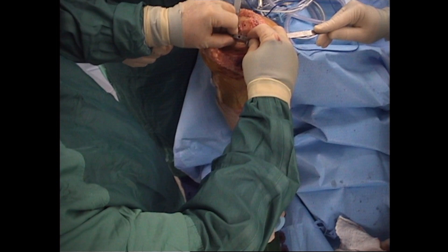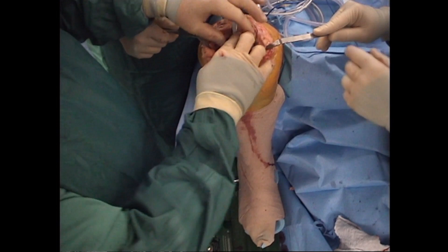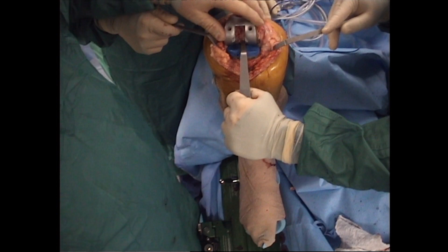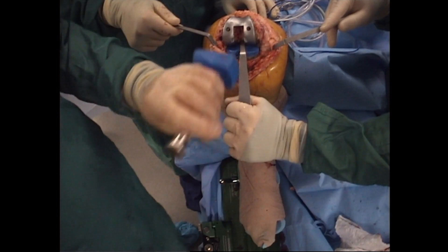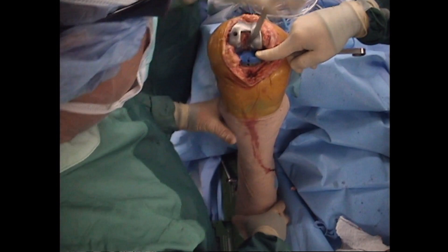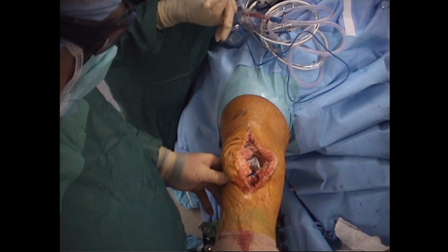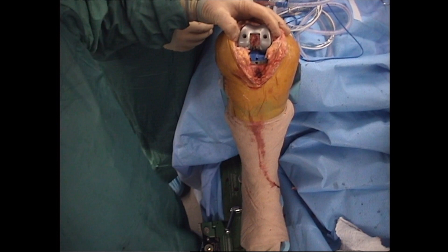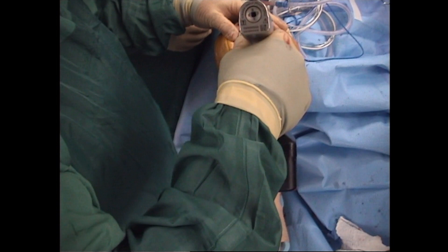Trial tibia is placed, as well as a trial insert. The knee is brought back to slight extension, and the femoral trial is impacted in place. At this point, the femur can be medial or lateralized as needed. Flexion and extension gaps, as well as patellar tracking, are then tested. Flexion and extension gaps are confirmed, and the femoral lug holes are drilled.